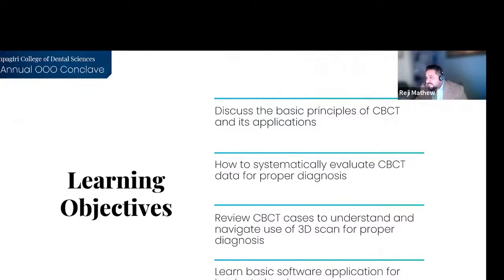If there is any pathology in that scan, by rule we are liable for those lesions. So how we teach our students is to look systematically. Don't look at the pathology which is right in front of your eyes. For example, you might be taking a CBCT to evaluate a third molar extraction. Do not go straight away to look at that third molar. Even in a panoramic image, don't look at the third molar first. Evaluate in a systematic order, and finally, the last thing is to look at the region of interest, or why you took the scan.